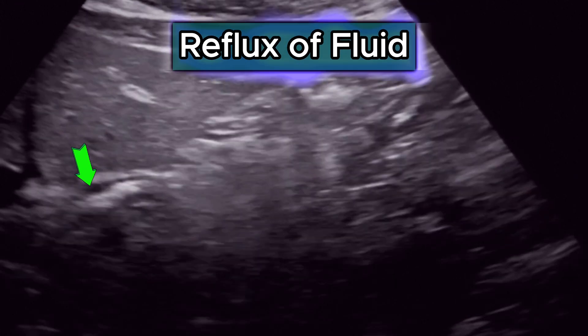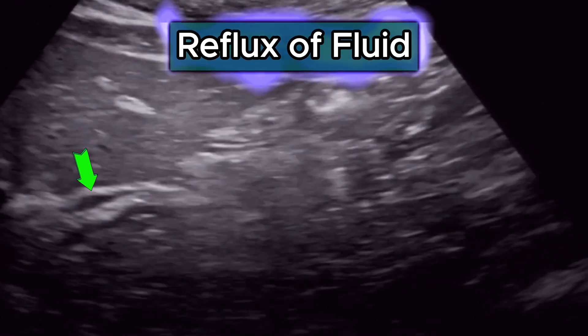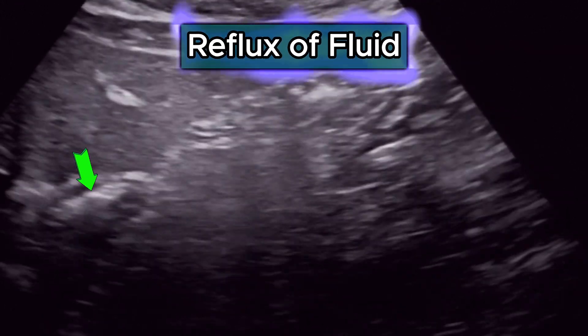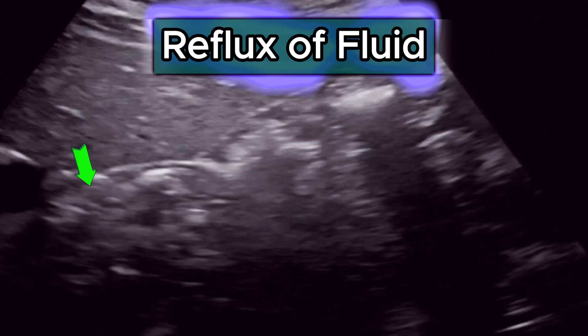We can see instant flow of hyperechoic fluid without any Valsalva maneuver or pressure, in the supine position.